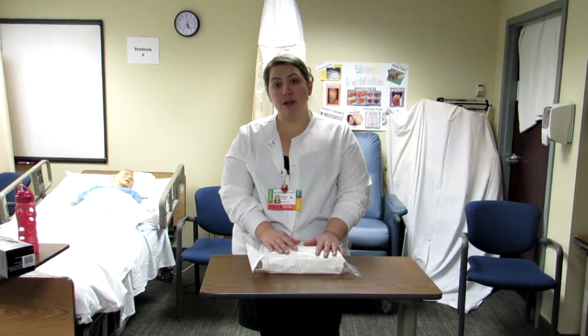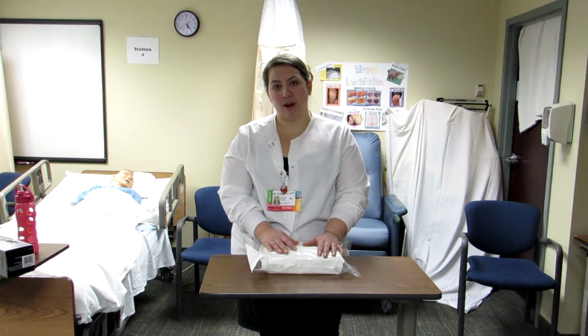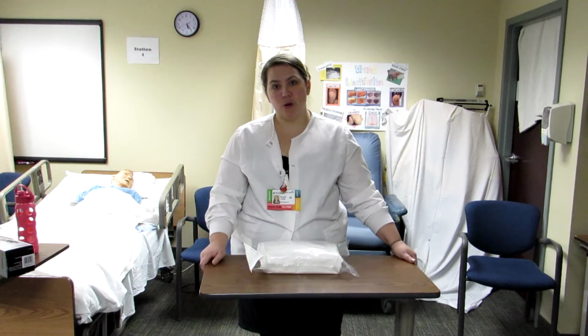I'm going to make sure that I do my AIDET, and I'm going to do a lot of explaining to my patient, especially if they've never had a Foley catheter. So we're going to head on into the patient's room.